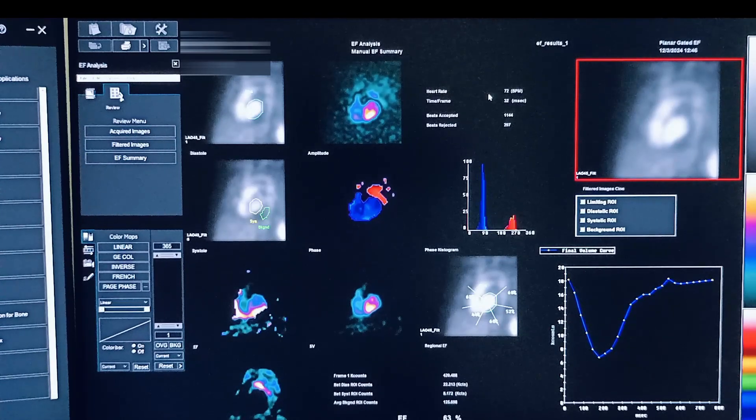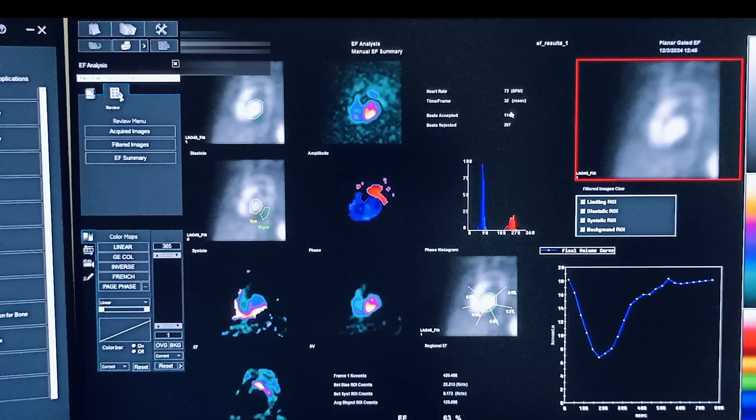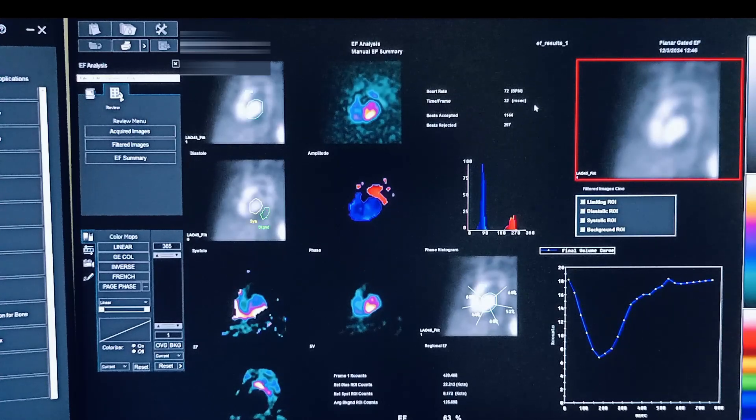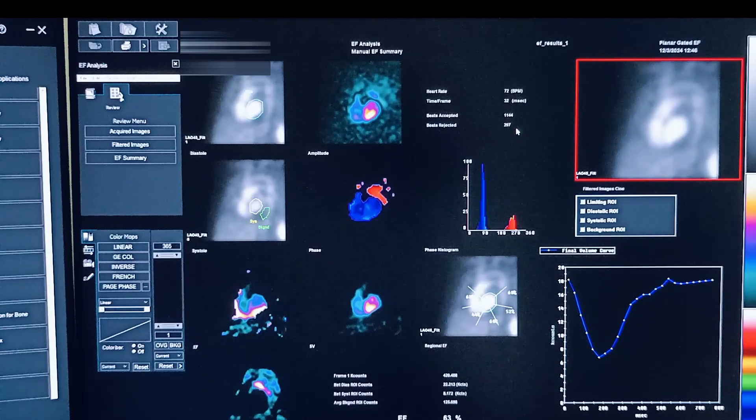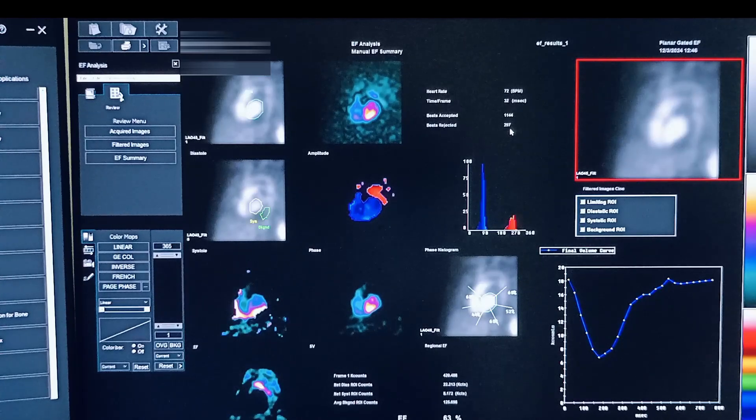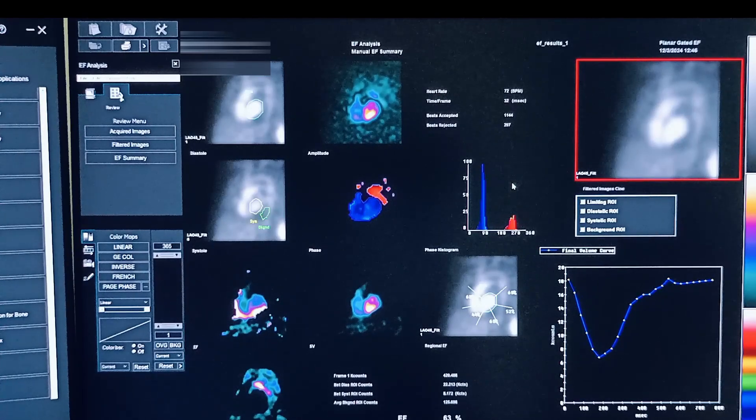So it displays all the results like heart rate, the time frame in milliseconds, beats accepted, number of beats accepted, and then number of beats rejected.